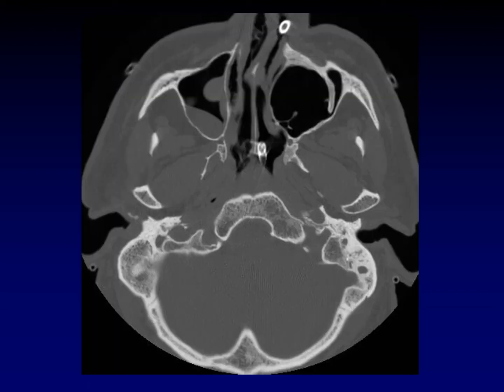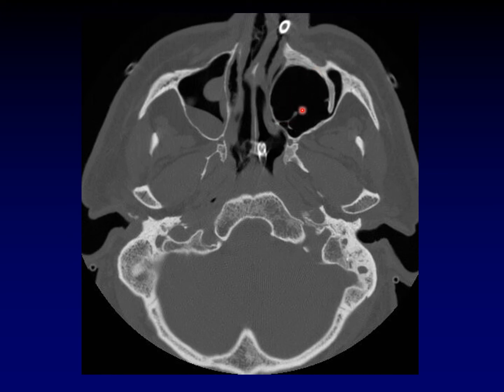Pneumosinus dilatans is an odd disease. It looks a lot like a mucocele would look, with expansion of the walls of the sinus and a spherical configuration to the sinus. But instead of being filled with mucus, this sinus is filled with air. Presumably this is some ball-valve effect that is causing the sinus to dilate, and you can imagine the mass effect upon the orbit in the same way that a mucocele would have.